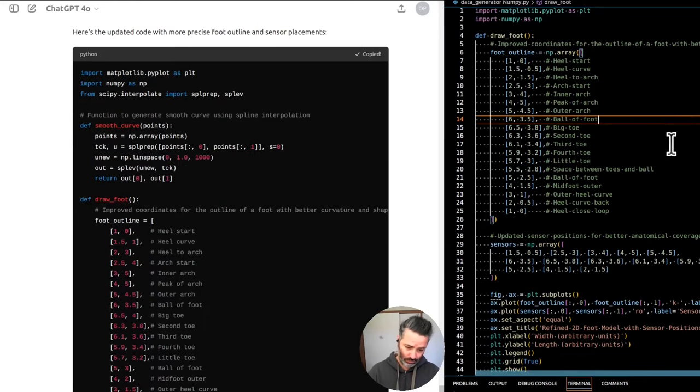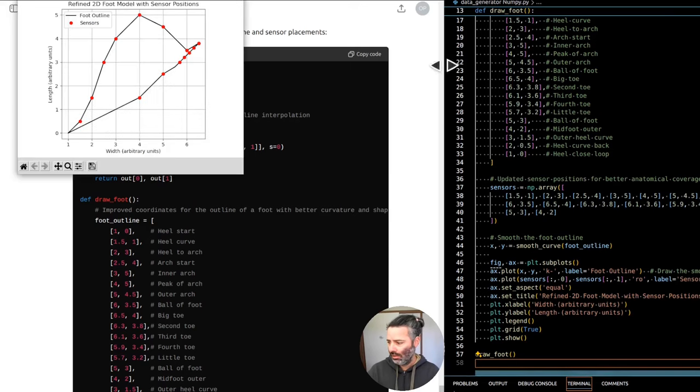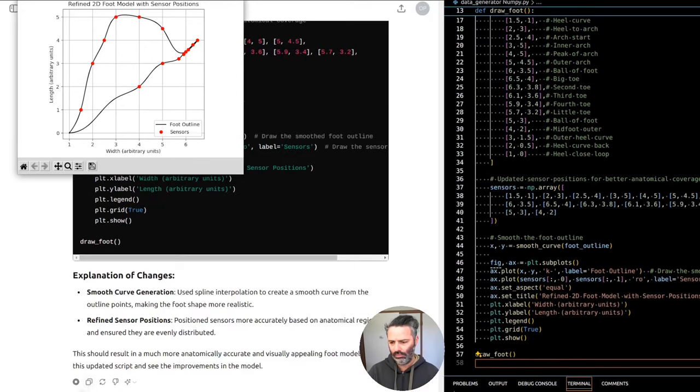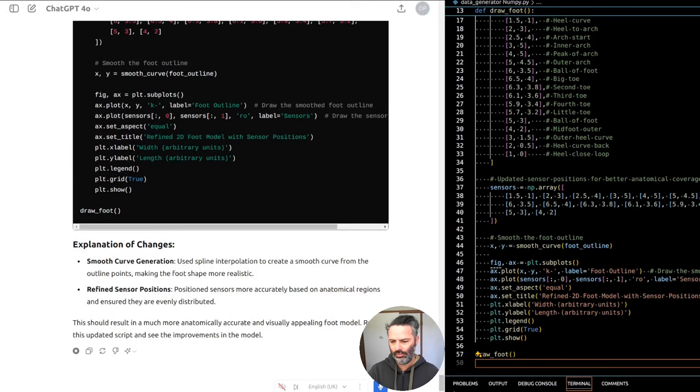It seems the updated foot model is still not meeting expectations in terms of accuracy and realism. Let's take a more precise approach to create a more anatomically accurate foot model by refining both the foot outline and the sensor positions. I will include more points to create a smoother outline and use better approximations for the anatomical structure of the foot. Issues identified. 1. Angular shape.